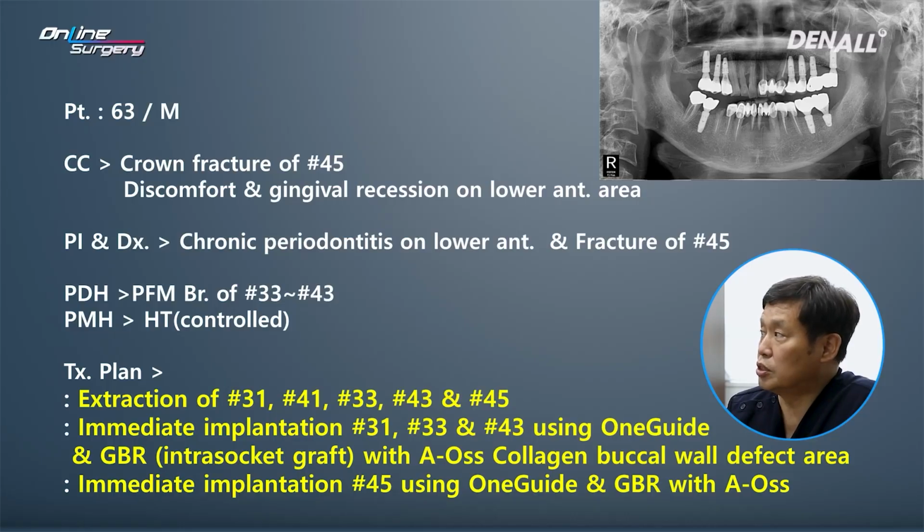The surgical plan is to extract the 4 remaining teeth between the canines and the lower anterior and place immediate implants. The plan was to extract the 4 lower anteriors followed by immediate implant placement. Based on the CT scan, it seems we will likely need to place a narrow 3.0 implant in the central incisor area with 4.0 or 3.5 implants planned for the canines.